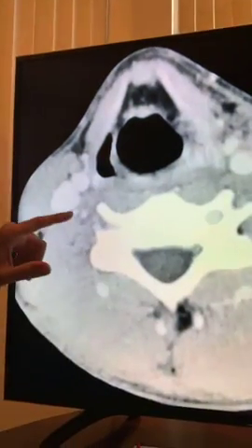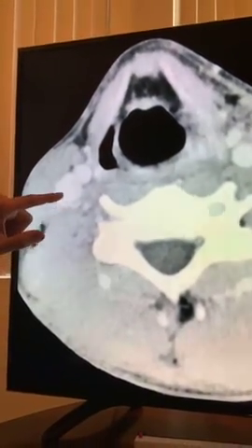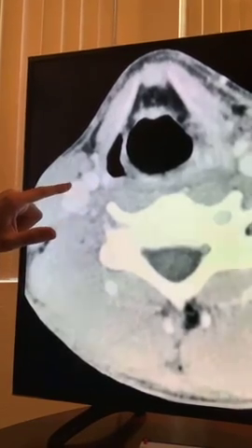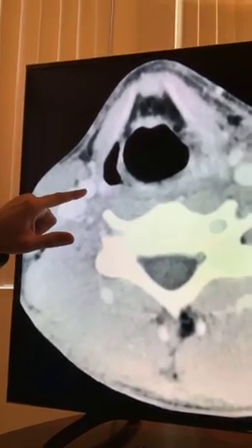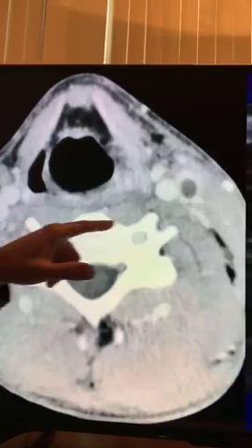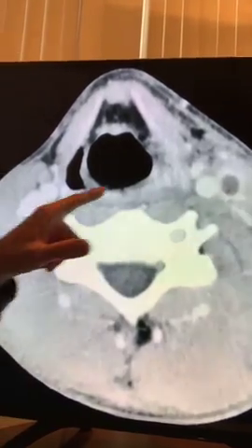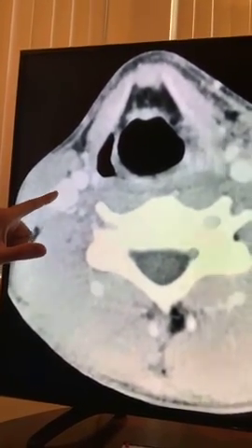If you have a carotid artery thrombus, that's going to lead to a stroke, possibly. That's pretty bad. So what I want you to notice is that rule of thumb: veins are bigger than arteries. I'll say that again. Veins are bigger than arteries, all right? So you look on this side, veins are bigger than arteries, okay? And we know that the vein is lateral, the artery is more medial, and right here, vein, and then arteries.